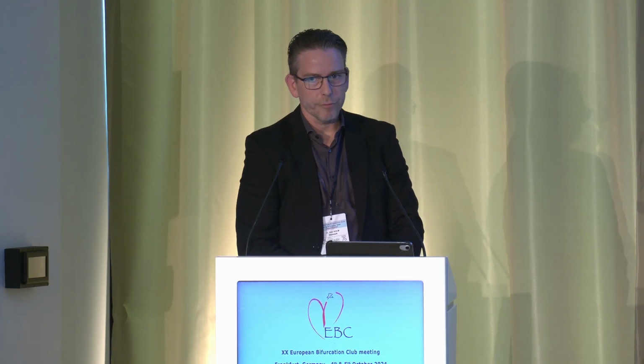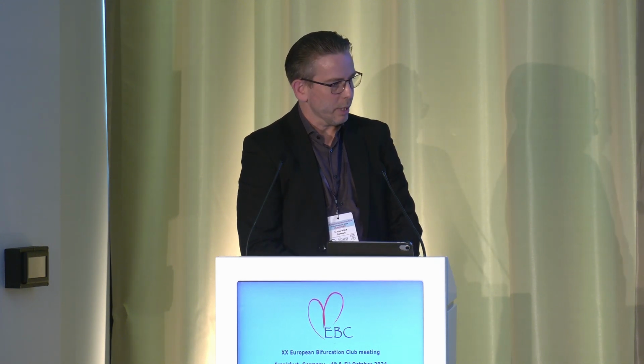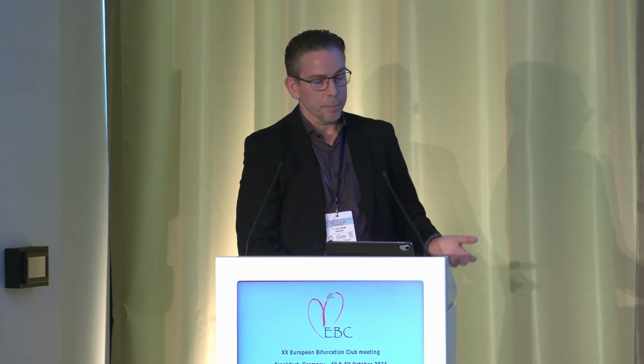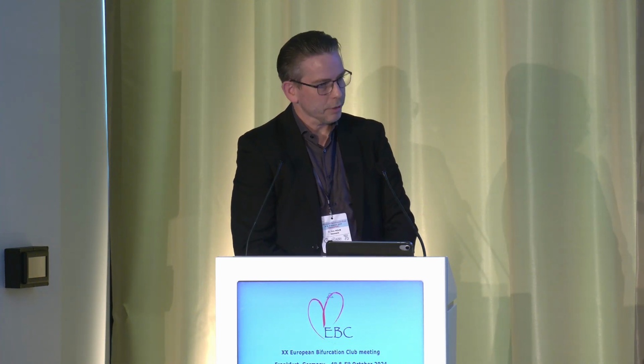Yeah, I think it comes down to training. Use it routinely, and then get feedback on your cases. So one thing is to do it in clinical practice, but if you are not trained or getting feedback, you will not develop further from that. Some of these findings are quite subtle and can be difficult to identify even with OCT, and by IVUS they're completely missed. So I think it's about the training, and it's about working with the quality of your work and interpretation.